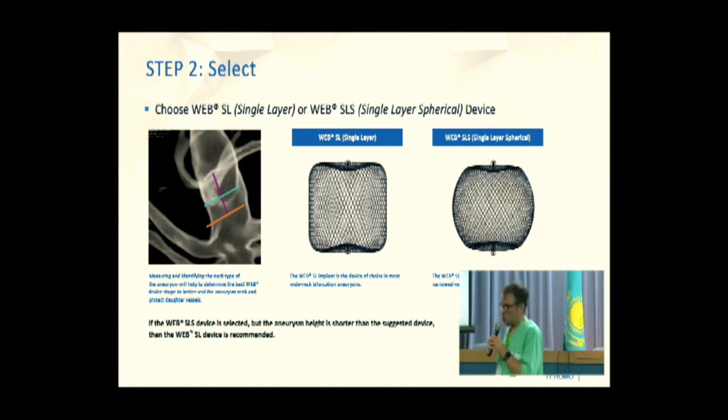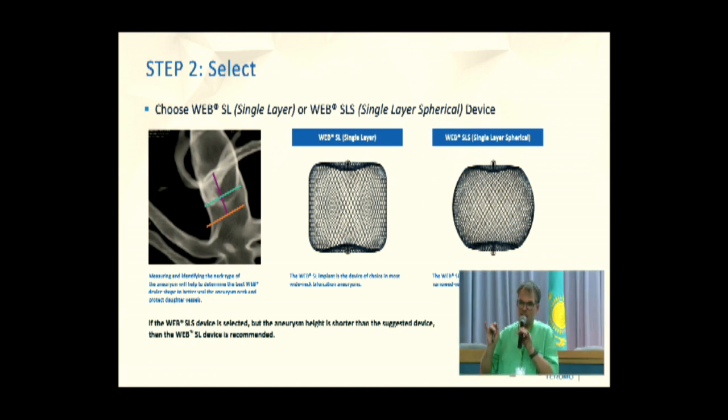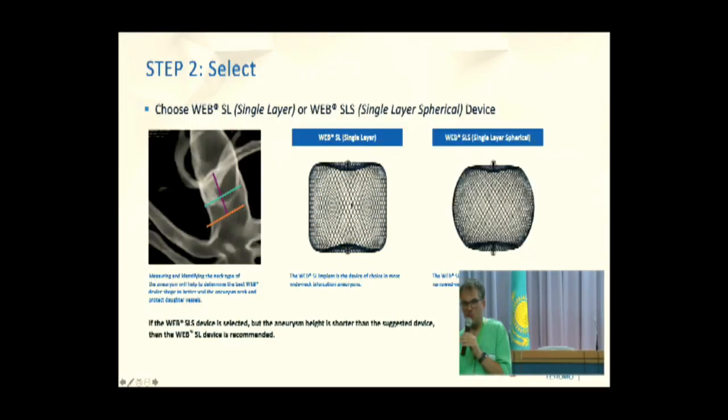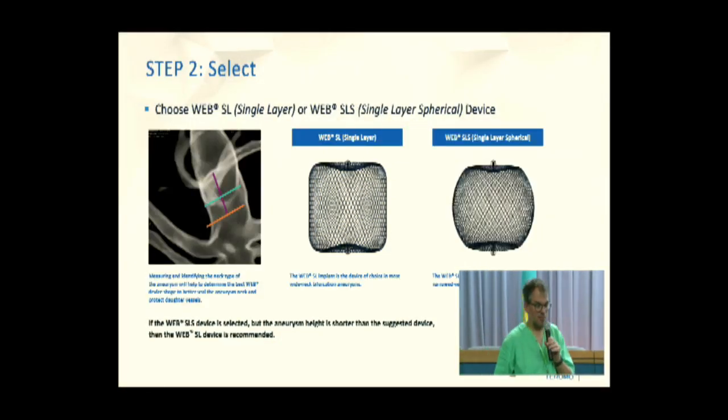But if you are unsure, or if you have a clear, very wide neck situation, tend to the cylindrical shape, because that's what we use in 85% of all cases.